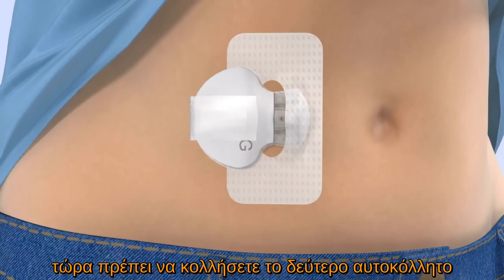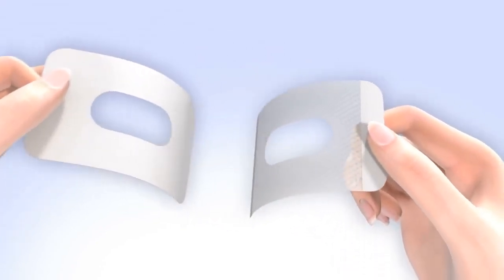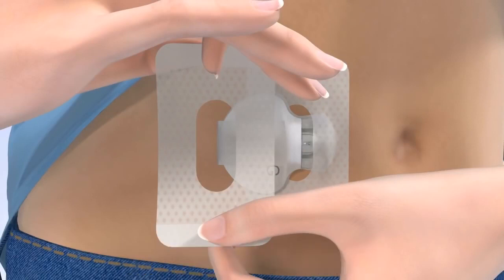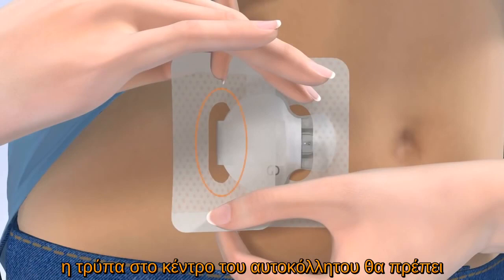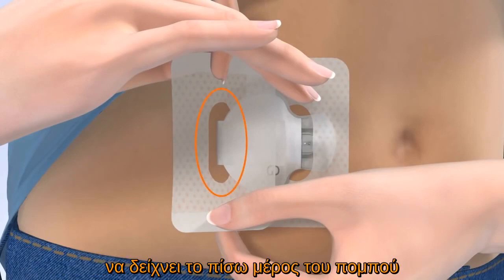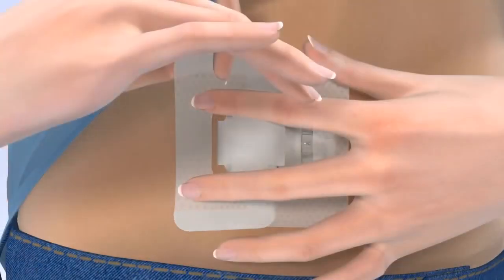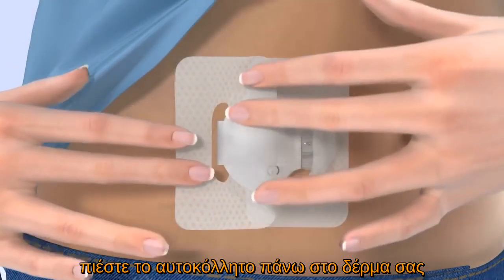Now apply a second piece of overtape to the sensor and transmitter. Remove the paper backing marked by the number 1. Hold the overtape by the covered ends and position it oriented the same way as the first piece of tape. Apply one side of the overtape to cover the center of the transmitter and apply the other side directly on your skin. The hole in the center of the tape should expose the back of the transmitter. Smooth down the tape on your skin and transmitter. Finally, remove the paper backing marked number 2 and press the remaining overtape against your skin.